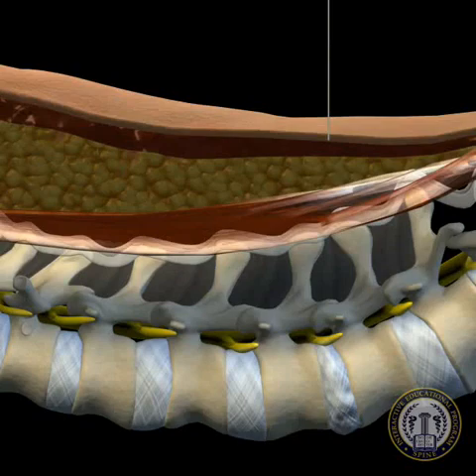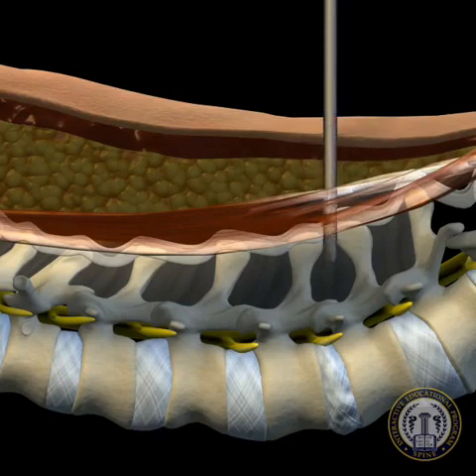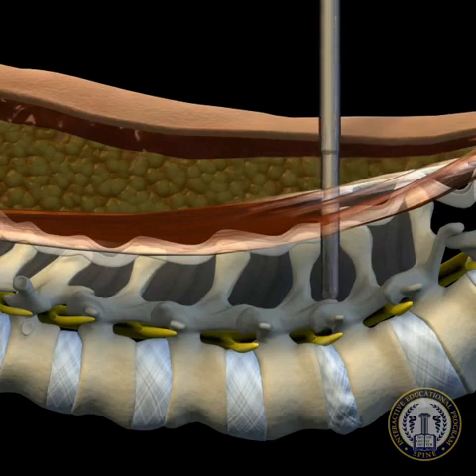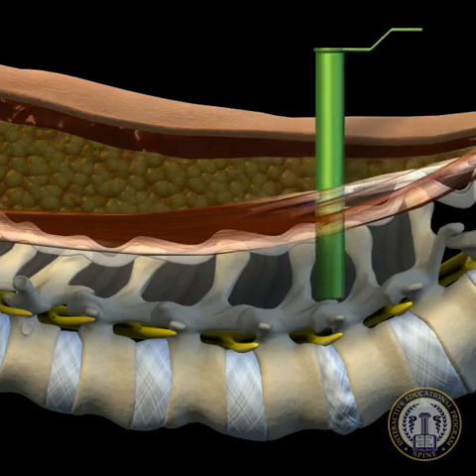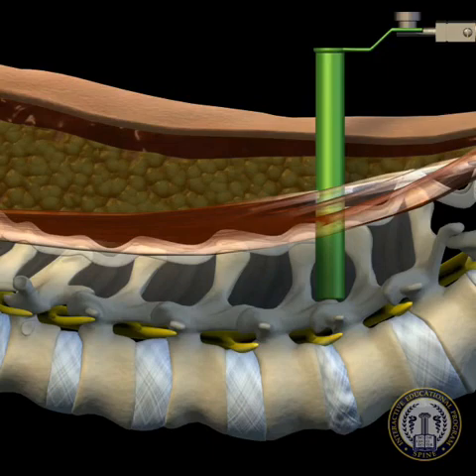To minimize risk of neural injury, the wire is passed only through the fascia and muscle. Serial dilators are then passed over the wire to develop a muscle-splitting surgical channel. A properly sized tubular retractor is then passed over the dilators and is attached to the table frame via a flexible articulated frame. From this point forward, the procedure may be performed using either an operative microscope or an illuminated tube with loop magnification based on surgeon preference.